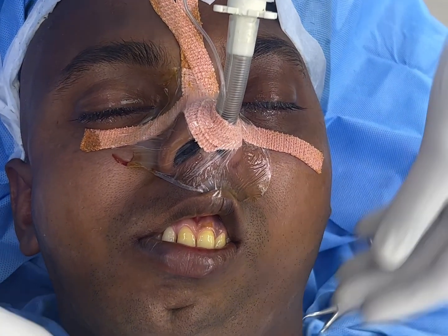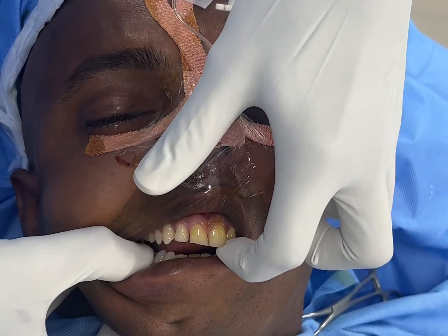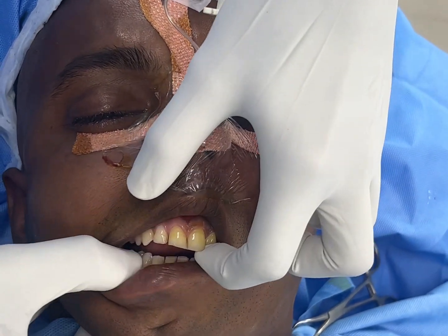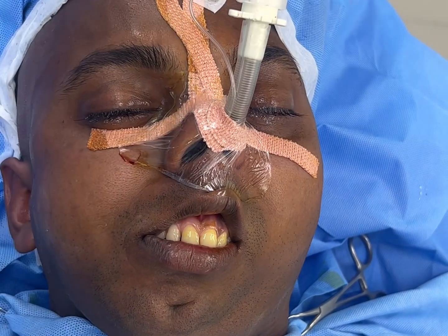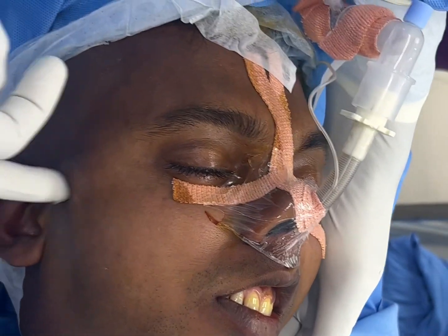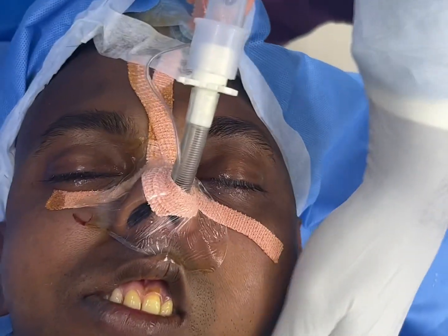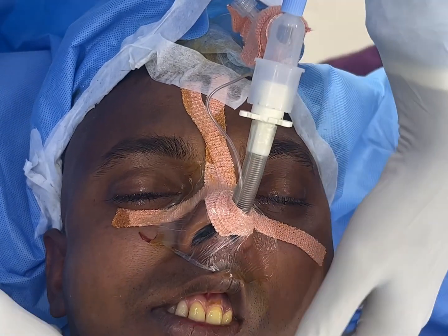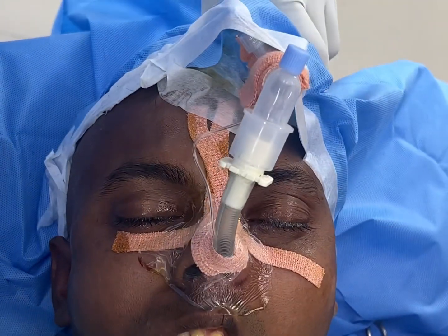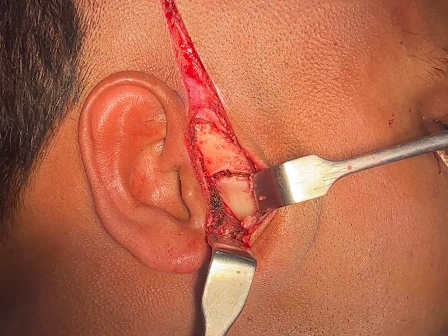We have a patient here who's not able to open his mouth. The maximum he can open is less than one centimeter — we call this temporomandibular joint ankylosis. He's also having issues with facial asymmetry; look how his face is totally sunken on the left side, and there's an issue with the chin. We're going to correct all of this in one go.